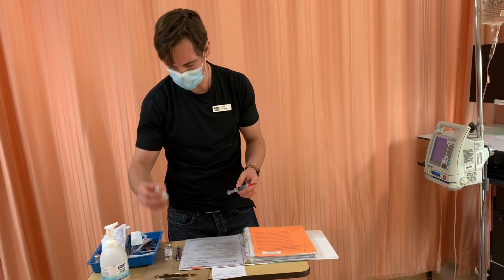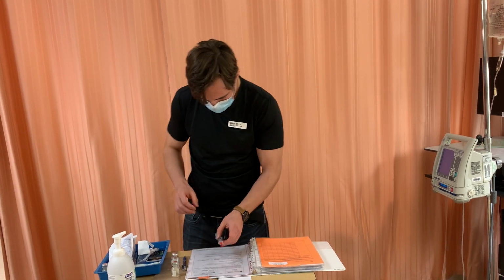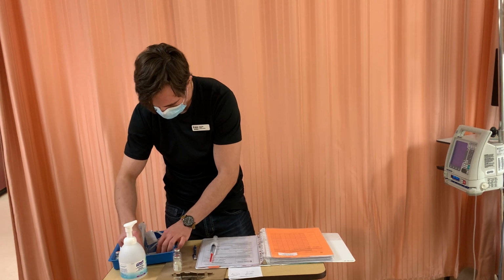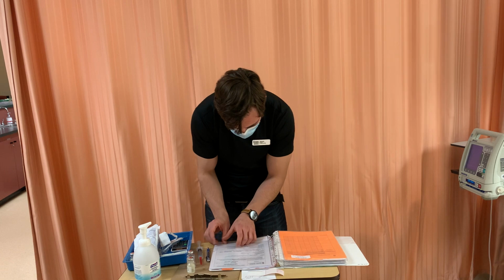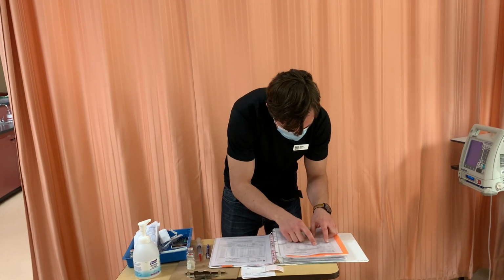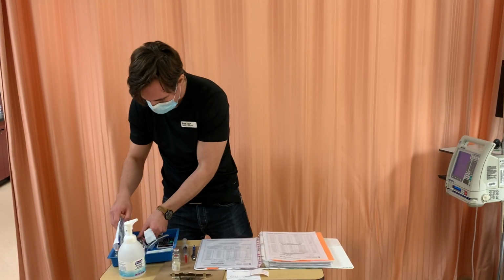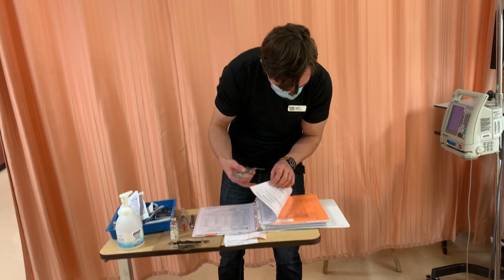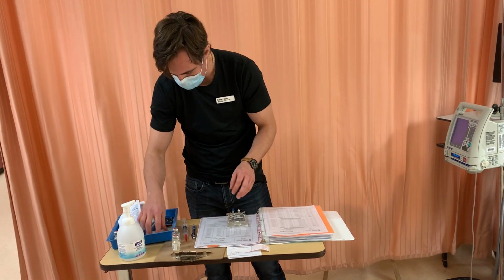And I also am going to note that I have checked our sterile water and it is not expired either. So next I'm going to figure out here. We need to dilute this in a 100 ml mini bag of normal saline, our dose of 500 milligrams. So here's my normal saline.